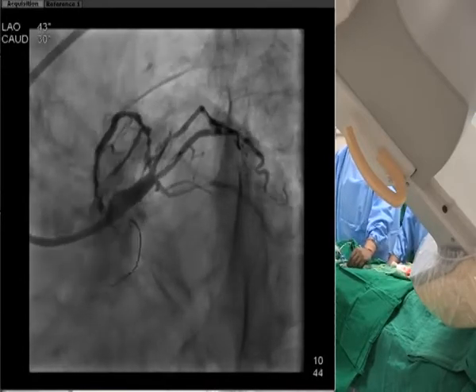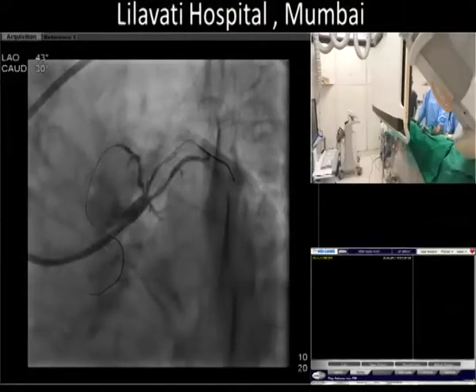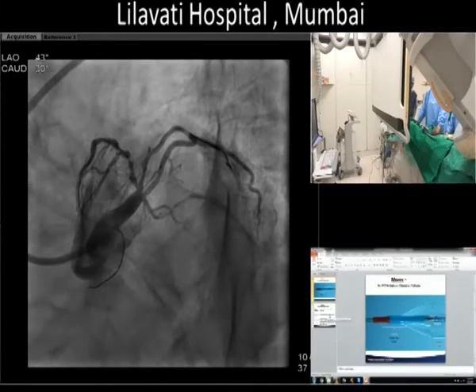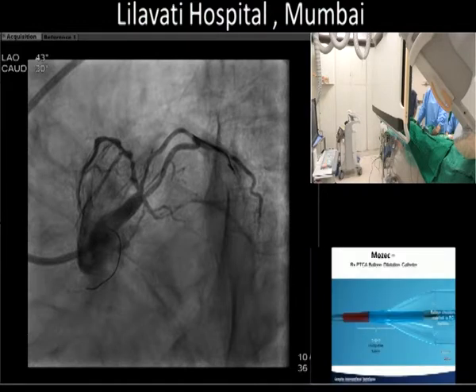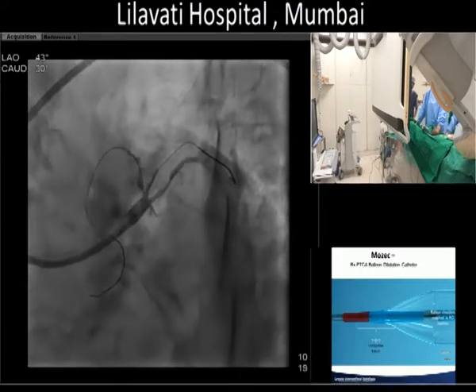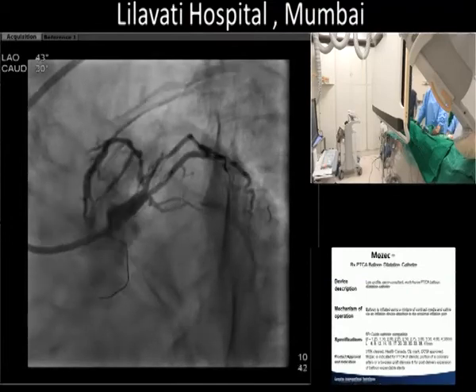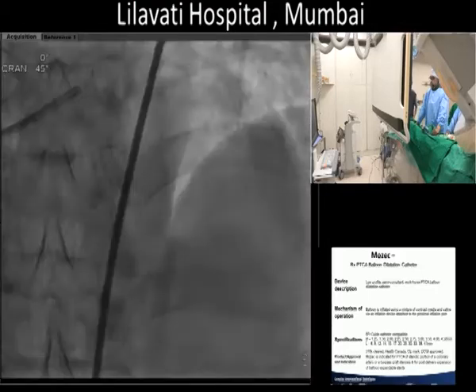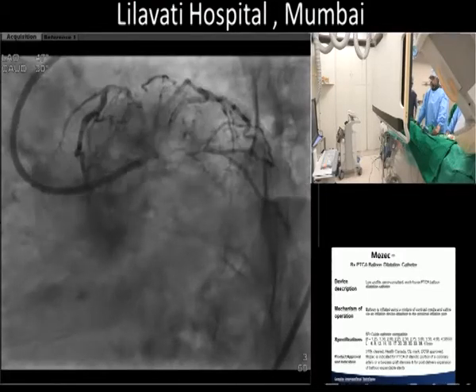So my thought is I would leave the diagonal stent out of the LAD and stent the body of the diagonal, but not bring it back too close to compromise the LAD. But that's my thought. Again, it's hard to know without imaging. Okay. Yeah, let us look at it again on the LAO-caudal. Yeah, that's going to be stented. There's a dissection in the diag, but that's from predilatation. You expect that.